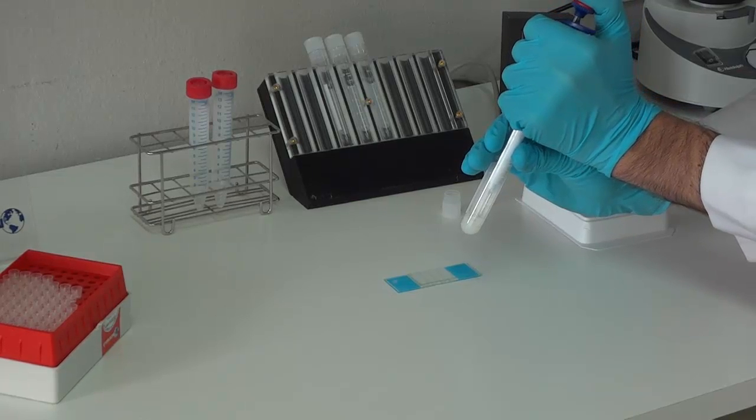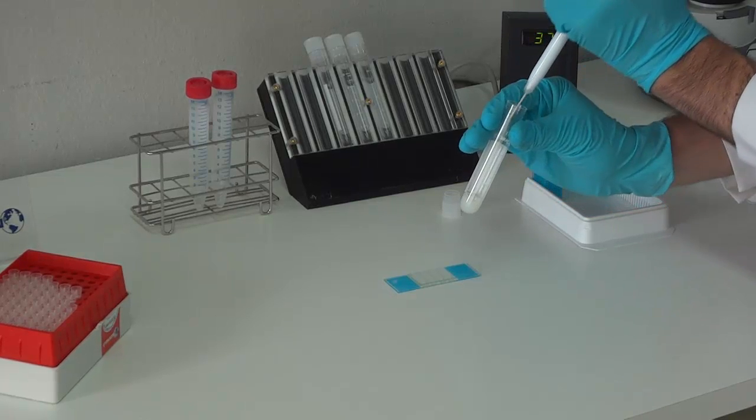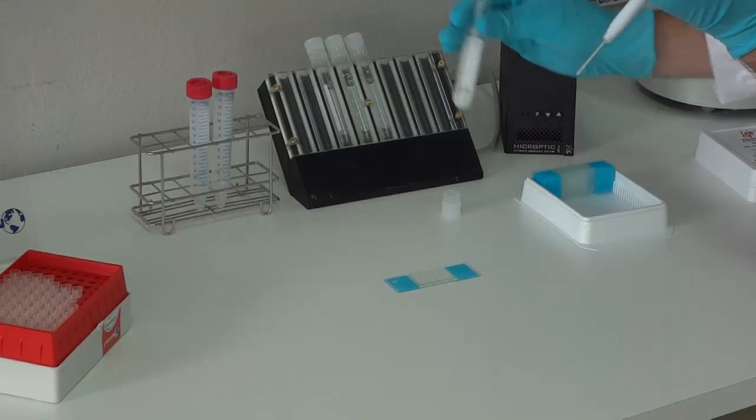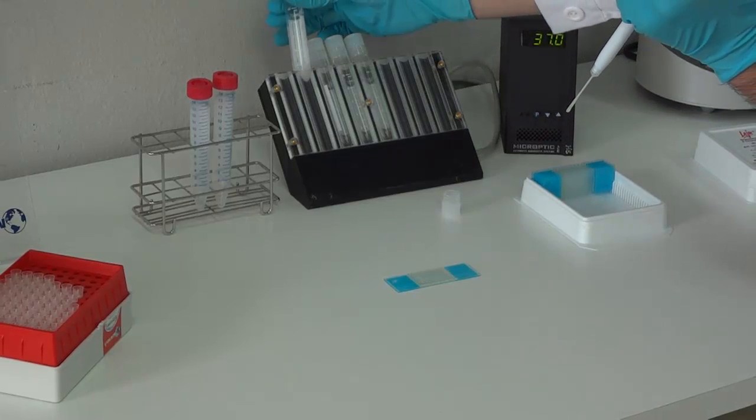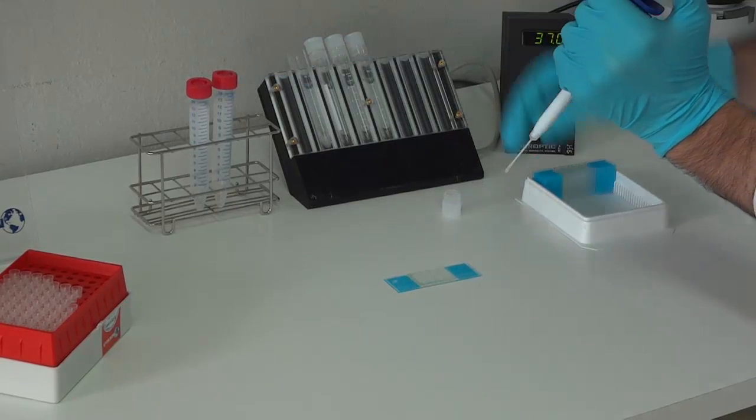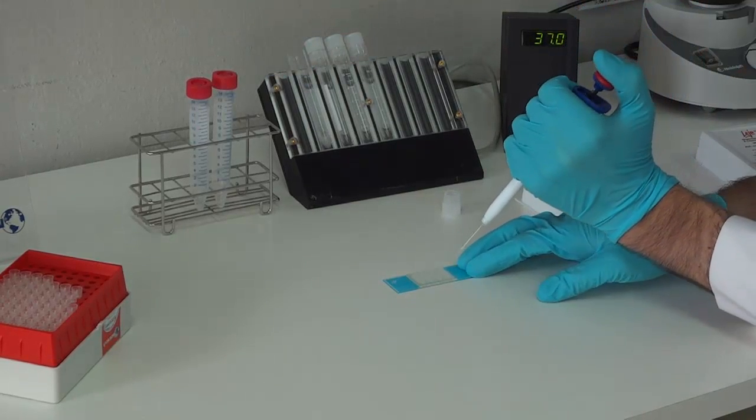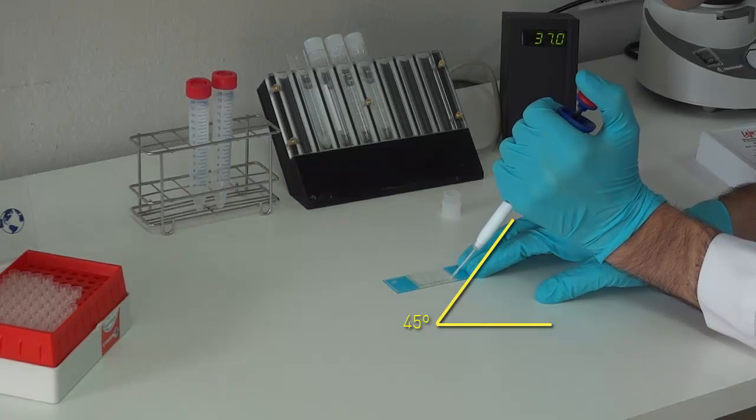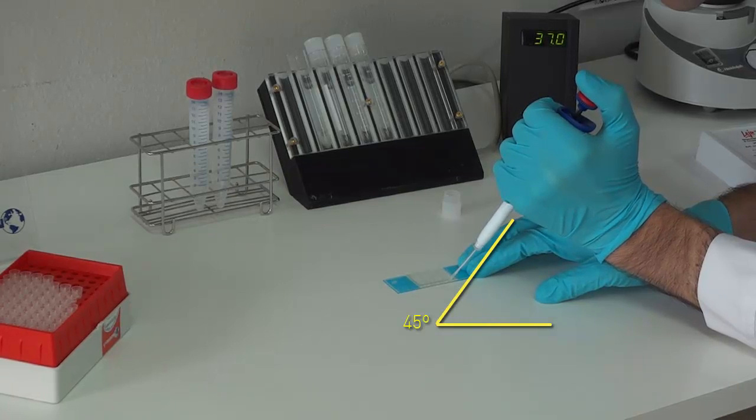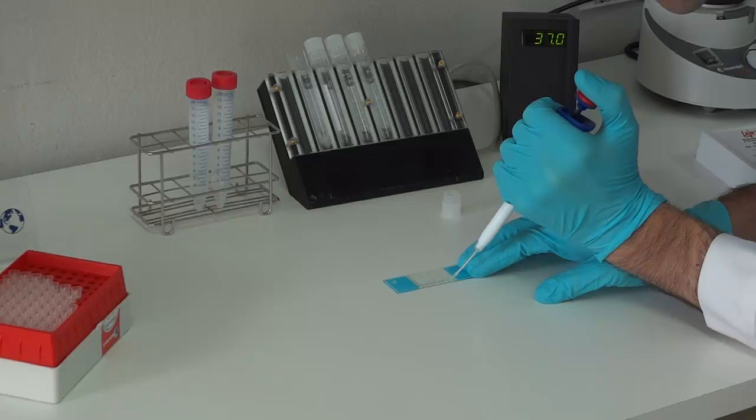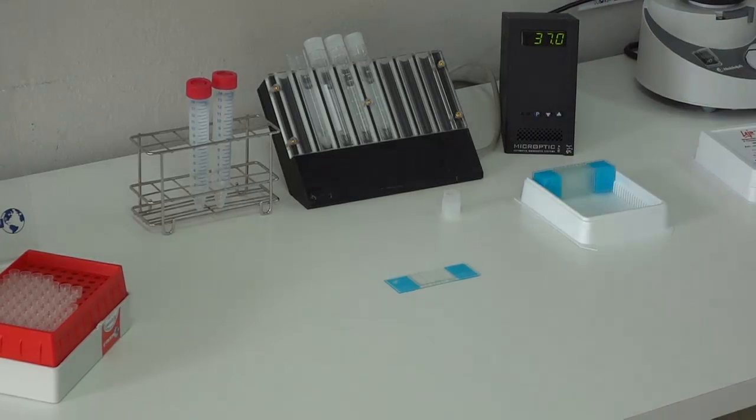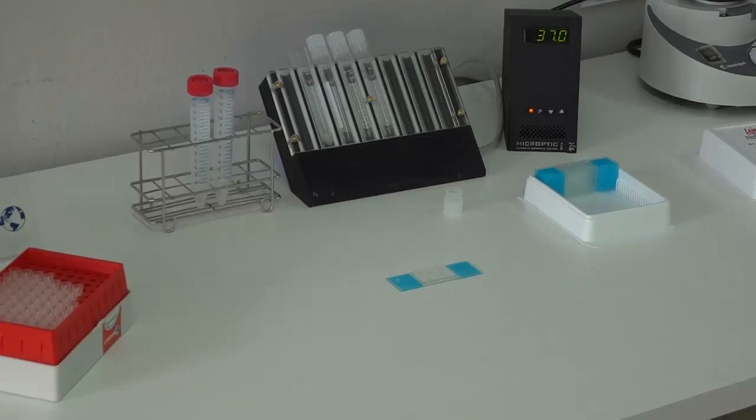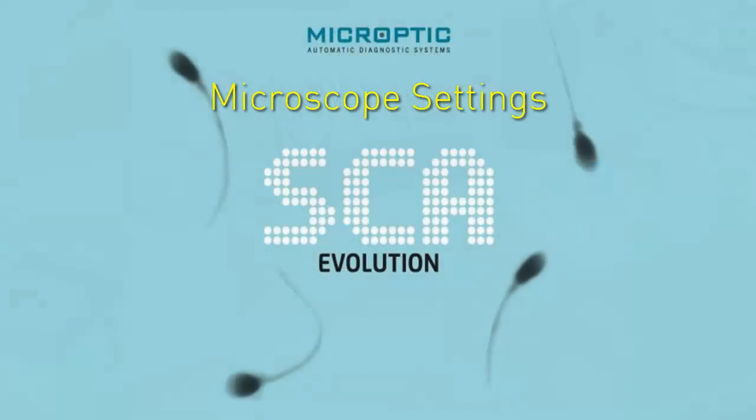Load the sample by placing the tip in one of the filling spots. Observe as the filling front reaches the outstream opening of the chamber. Then remove excess fluid. The slide is ready to be analyzed.